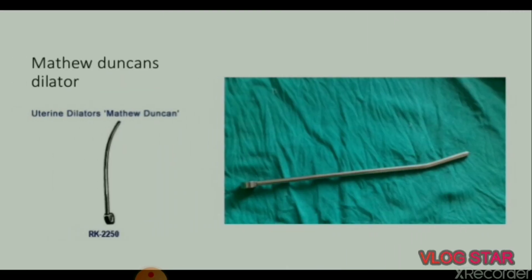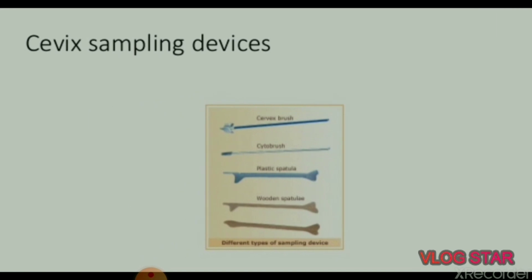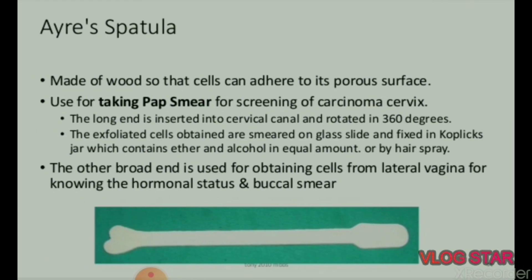Number 8 means an outer diameter of 8 mm. For D&C, dilation up to 8 is done. For MTP, dilation up to 12 may be required. Very large dilation can cause cervical incompetence and perforation. Next instrument is Matthew Duncan dilator.